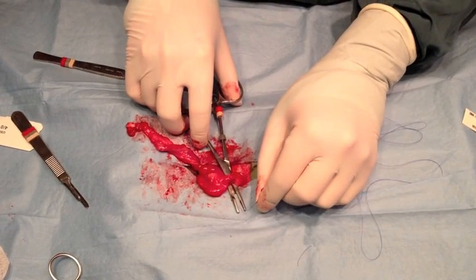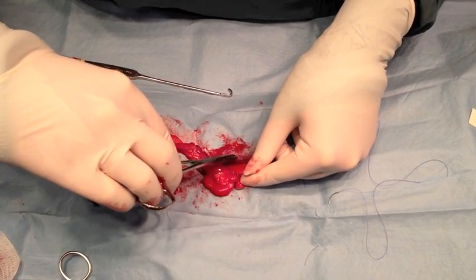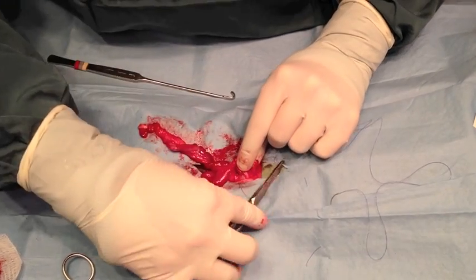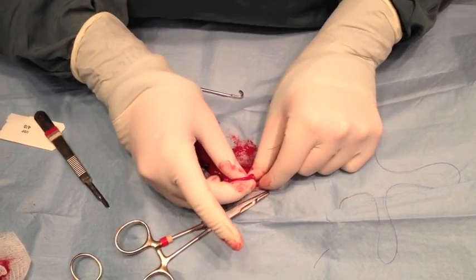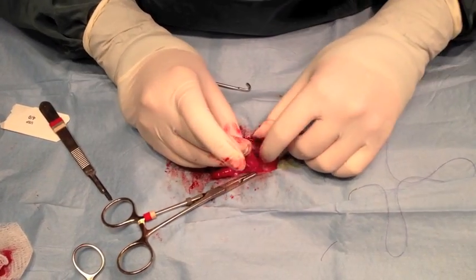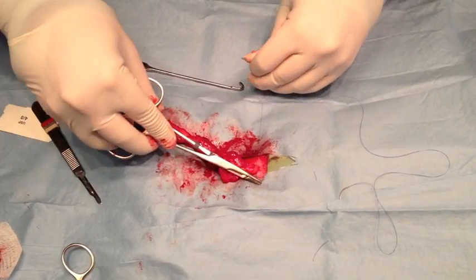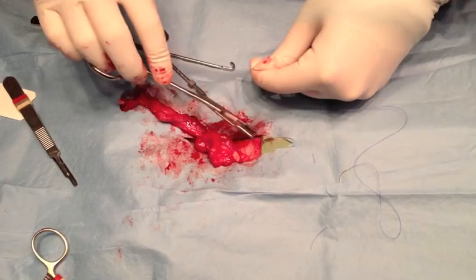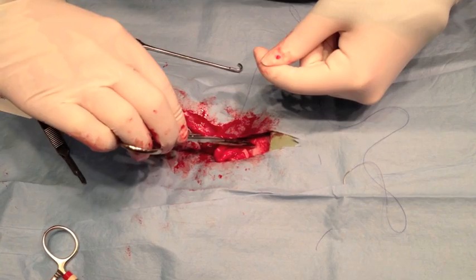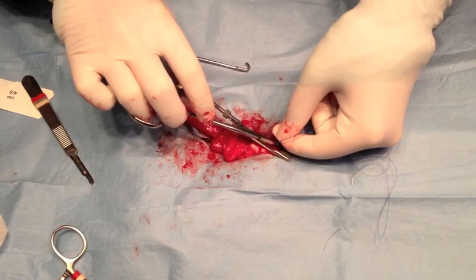I already did the other side — the hard side — first. Some people, to combat that, will make a much bigger incision, which I did not. I've done so many spays I don't really need a big incision just to get an ovary to come out. Especially in dogs, you have to pull and break the suspensory ligament to get the ovary up out of the incision. In cats, in my experience, you don't really need to break that suspensory ligament, but sometimes you do just to get the ovary to come up a little farther. Here I am tying off the ovarian pedicle underneath the ovary.